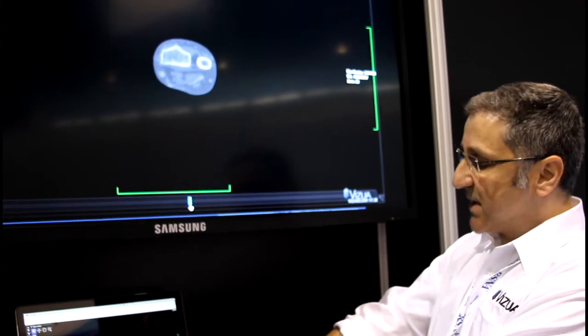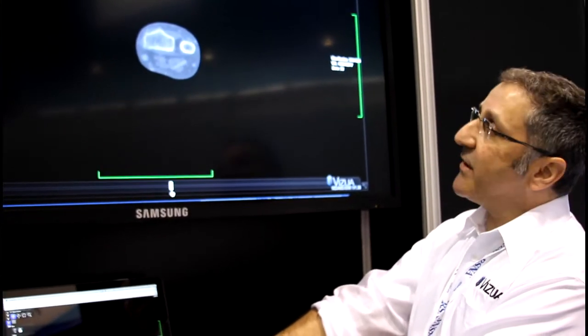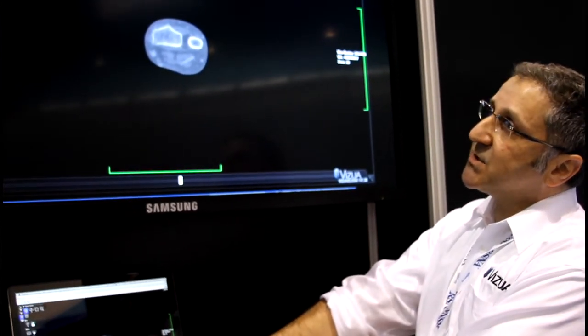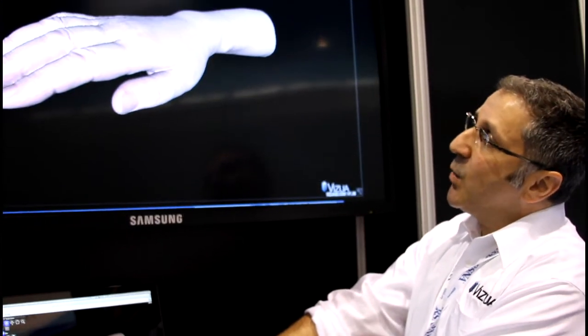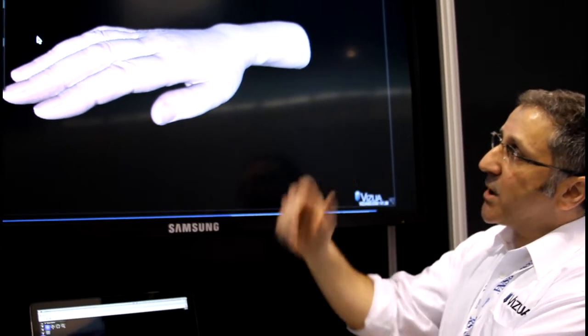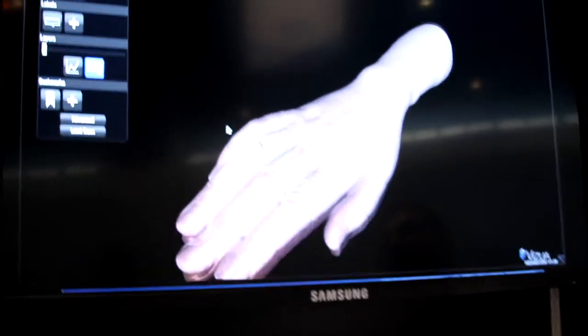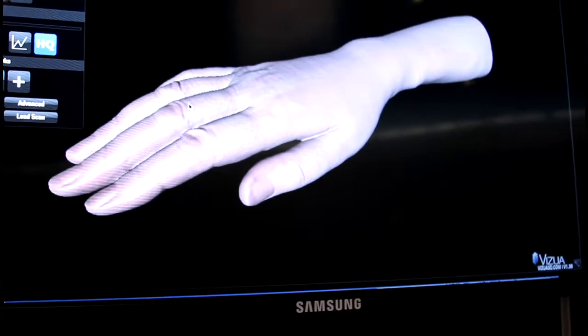This is a patient that presented with a swelling on their forearm. This is the 2D CT scan they got, just a regular one. When our system takes that data, we create a real-time 3D reconstruction, high speed, high quality.